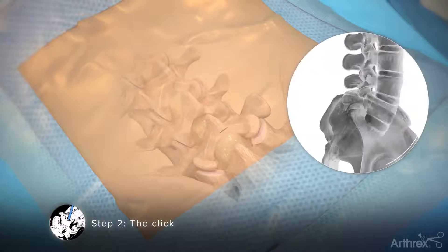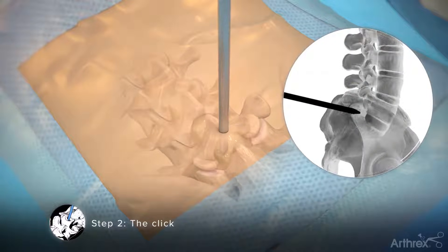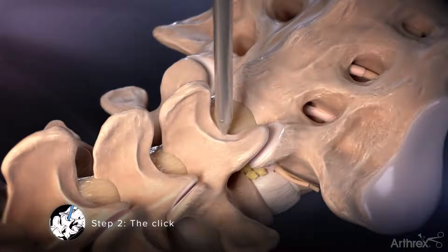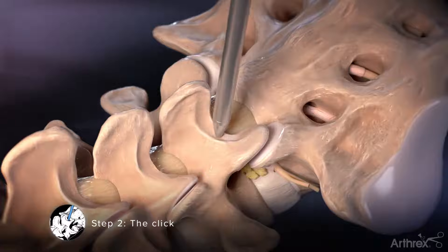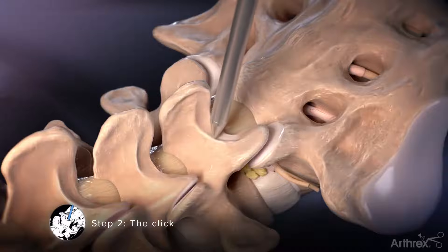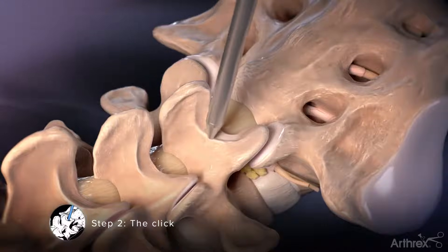Step 2: The Click. Use fluoroscopy and insert the switching stick into the interlaminar window and on top of the ligamentum flavum. The tip of the switching stick is used to traverse the inferior edge of the lamina in a caudal to cranial direction. This action should create a tactile click as the tip of the switching stick comes over the edge of the lamina.